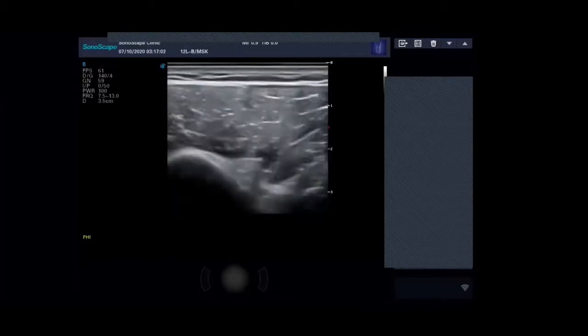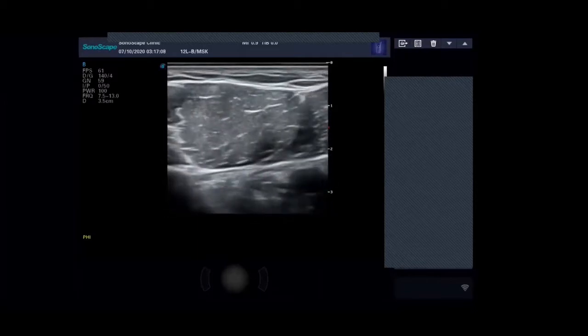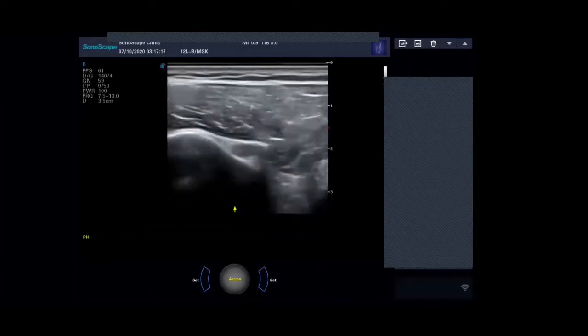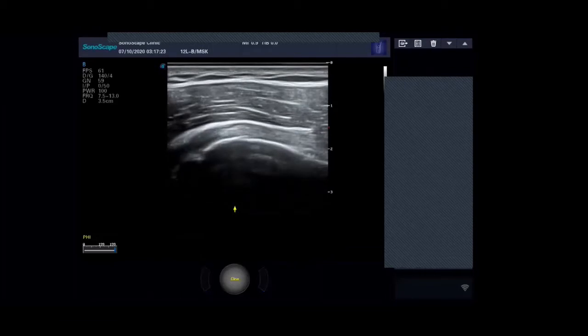So as we go down the tendon, just move that there, go down, there's the pec major tendon. There's an arrow that is going across here, so that's your landmark to come down to visualize it. And then I go back up and go in the long section. Okay, so the long section is here, you can see the tendon fibers nicely. Now this is going obviously down intra-articularly, which we won't see much of. If they've got a particularly shallow groove, then you might have a better chance of seeing the articulation intra-articularly a little bit, but if they've got a deep groove, you certainly won't, because it tends to attach a bit more posteriorly.